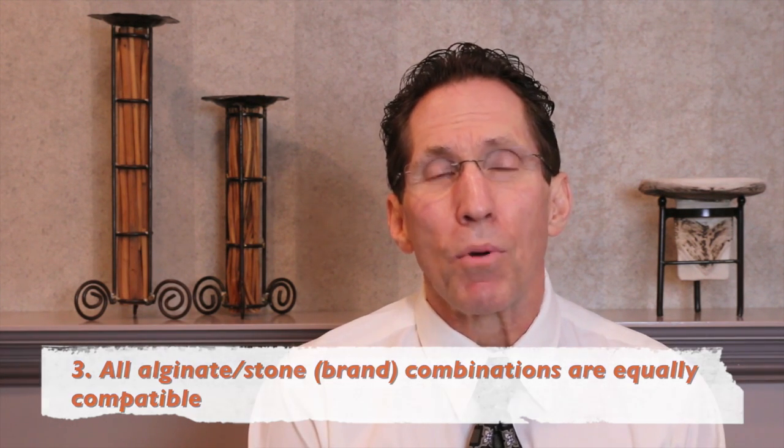You know, there are dozens of brands of stones, there are dozens of brands and types of alginates. And what we find is even though individually they may be very excellent, in combination they don't work very well. So we're going to discuss one specific combination of stone and alginate.